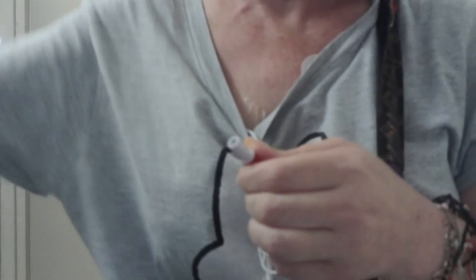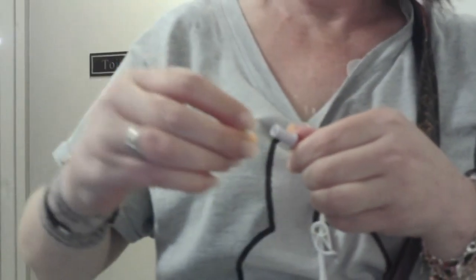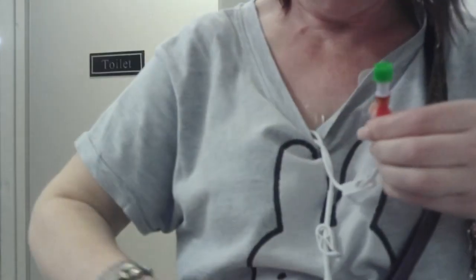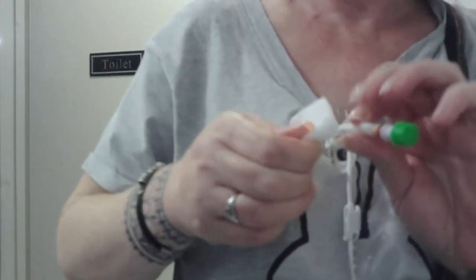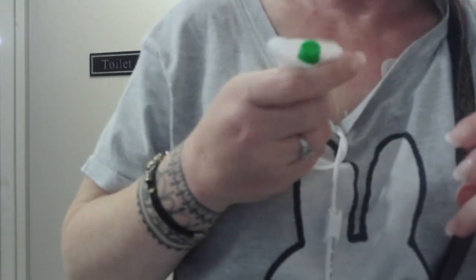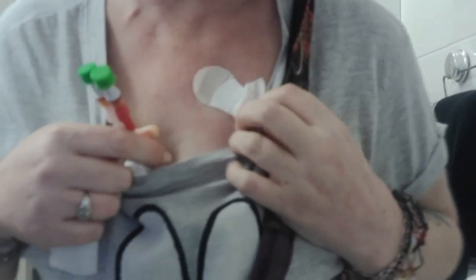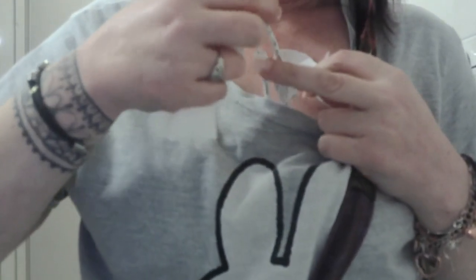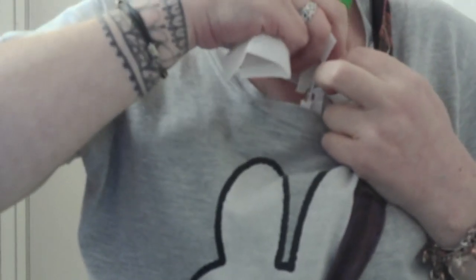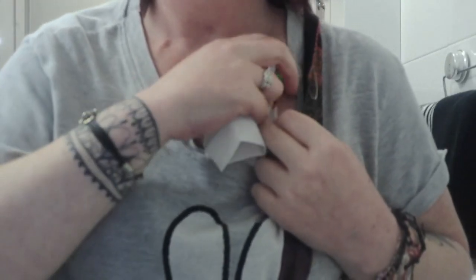Take that off. Put my cap on. Make sure they're tight enough, these. And then I'm going to give them both one more wipe, because I've touched them. Do my grip lock, and then I pop them in there. Don't want them too high, they'll annoy me.